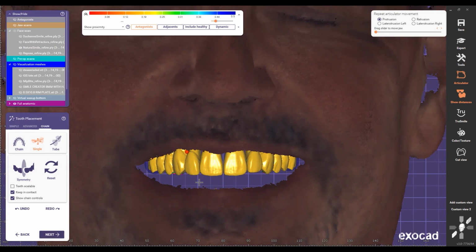So what I'm gonna do is use a flat card and put it right on the teeth, something like this, so that you just follow that flat line and it's just gonna give me more information. I'm gonna get a business card. In this case, I'm gonna use, sorry, a credit card here.